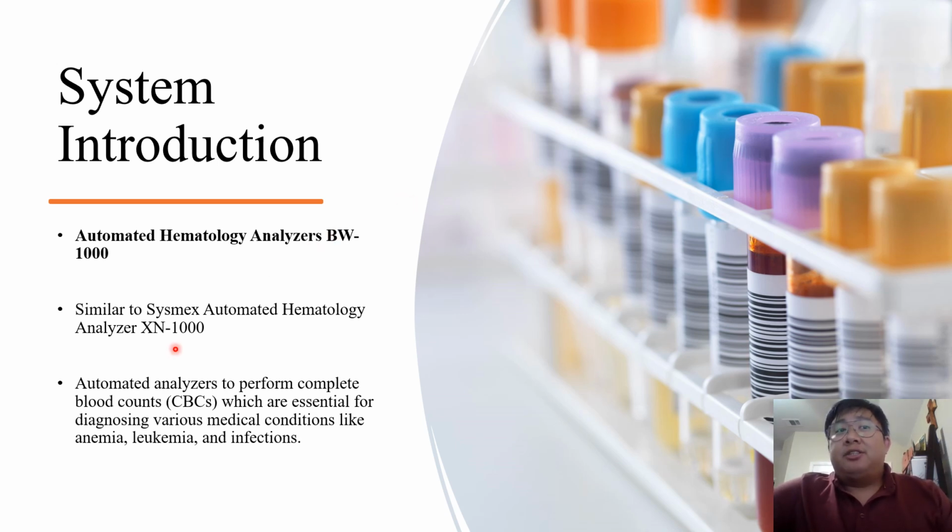It's similar to the Sysmex Automated Hematology Analyzer XN1000 that is currently used in private and public labs of every single hospital around the world. The reason why I don't introduce the XN1000 and change it to the BW1000 is because it would conflict with the copyright of the system that I currently work on.